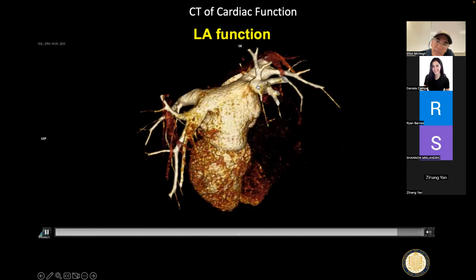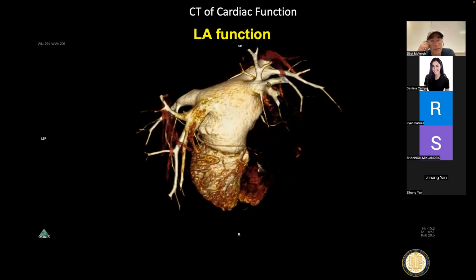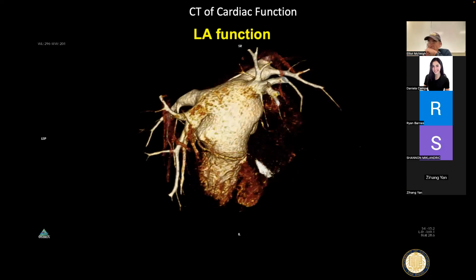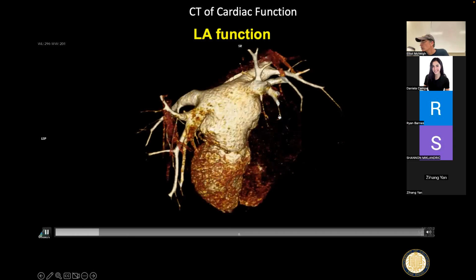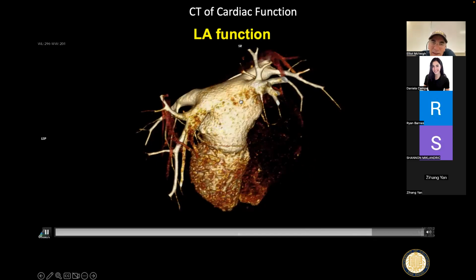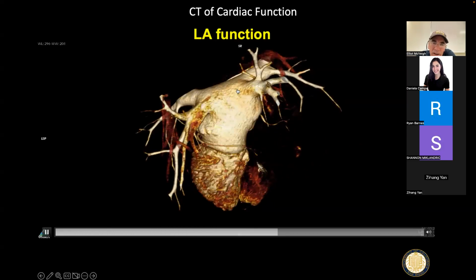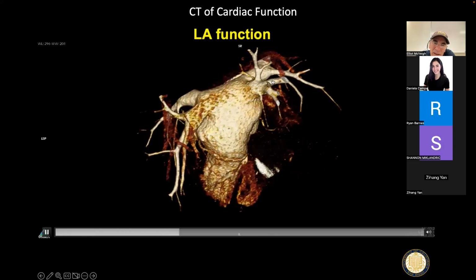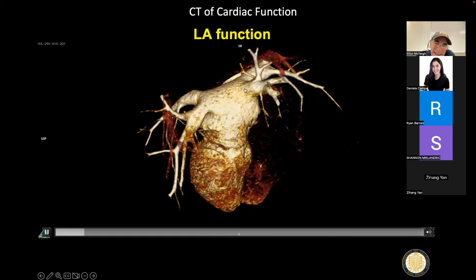But one thing I want you to recognize here also is you see when you go down a pulmonary vein here and it goes into the lungs, eventually it just stops moving with each heartbeat, right? The vessels, they're buried in the lungs. The atrium contracts. When you're far enough down here, those vessels are not going to move. All right. And then as we go in towards the left atrial myocardium, you can see it's contracting right here, right? So this is contractile tissue here. This is not here.